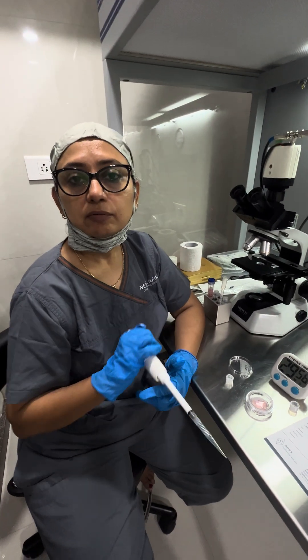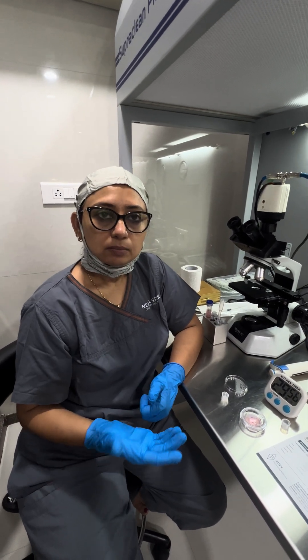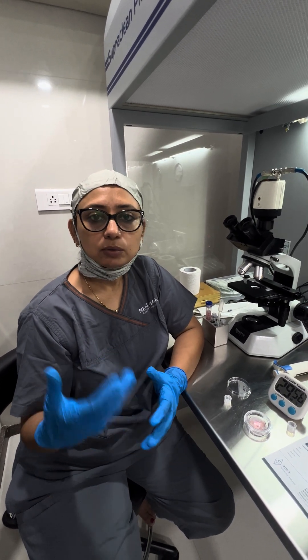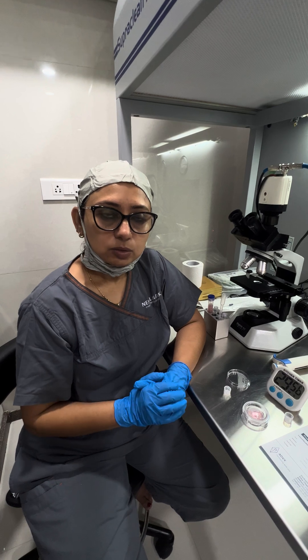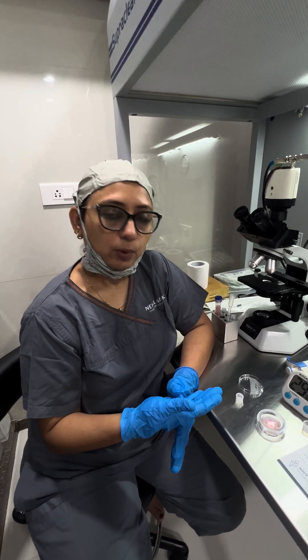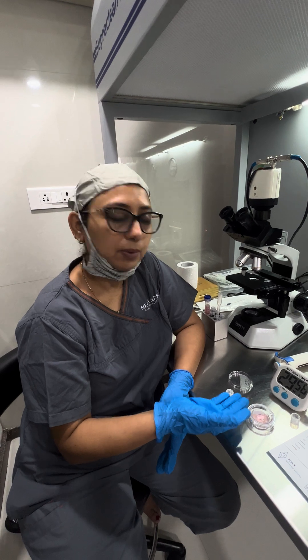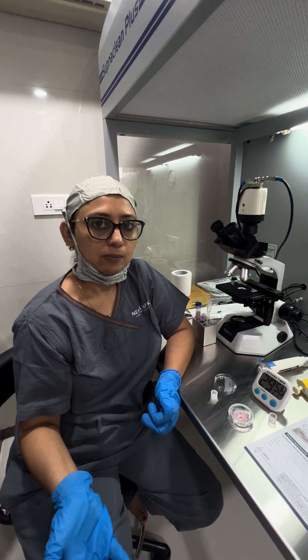This is how this plate works. I have used it for oligozoospermic samples, but in that case we have to either centrifuge the whole semen sample before processing, or after processing centrifuge the pellet, because low count doesn't work well with this plate. Either centrifuge it before, collect the pellet, add 0.5 ml of flushing media and perform this procedure; or after the procedure, collect the sample from the upper portion, centrifuge it, make the pellet, and then use it for IVF or ICSI.